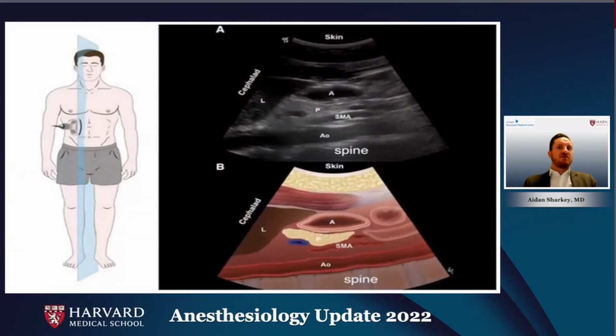The ultrasound transducer is placed perpendicular to the skin, sweeping from the left costal margin, seeking the following key sonographic landmarks from deep to superficial. They include the vertebral bodies, the long axis of the abdominal aorta, the head or neck of the pancreas, the inferior margin of the left lobe of the liver, and the gastric antrum in short axis. The liver provides a nice acoustic window to the gastric antrum, which can be distinguished from other hollow viscera, such as duodenum or bowel, by its thick hypoechoic muscularis layer, along with the hyperechoic serosa and mucosal layers.